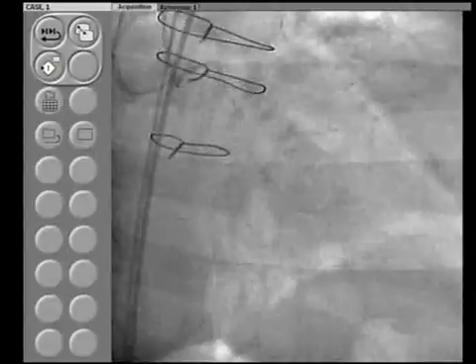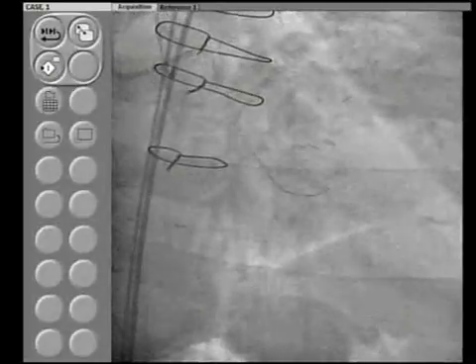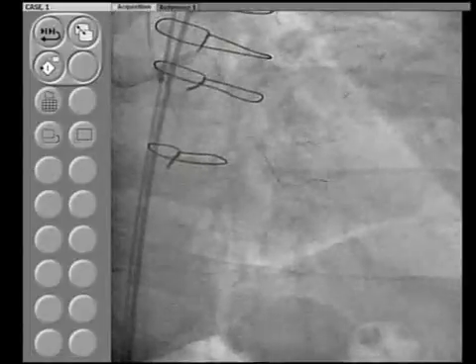Now what are you having in the tactile sensation? Let me check. No, the tactile sensation is the same. Everything is not transmitted because of the angle that we have at the left main. The other question is that I still feel that we should stabilize the left main and proximal circumflex, do the balloon dilatation, so that this ST depression and dampening, which are happening, will give us a little extra time to really deal with it. Or let me just try once again.